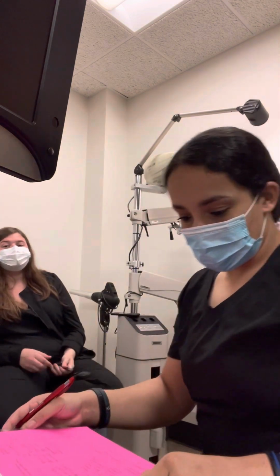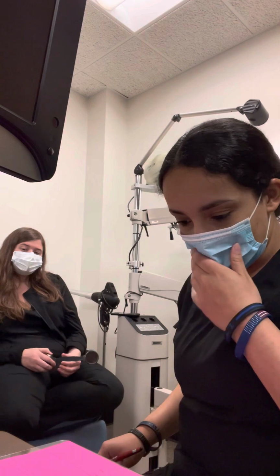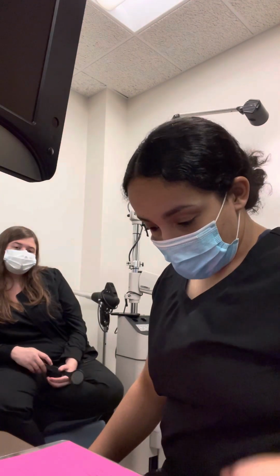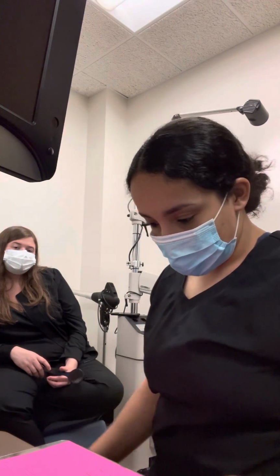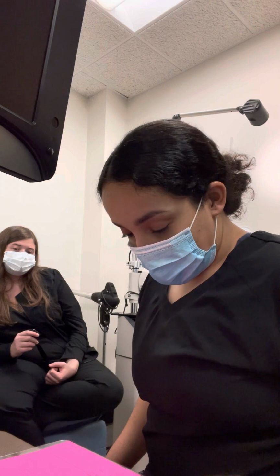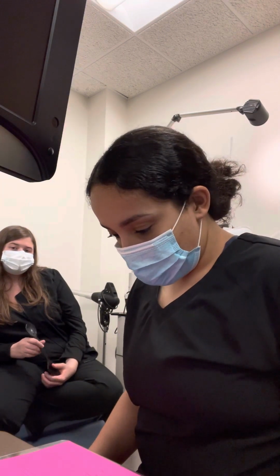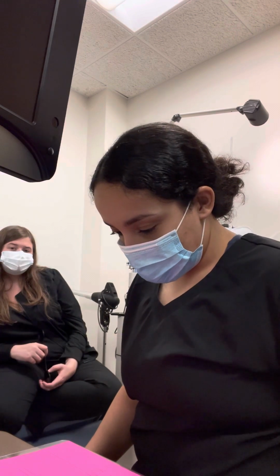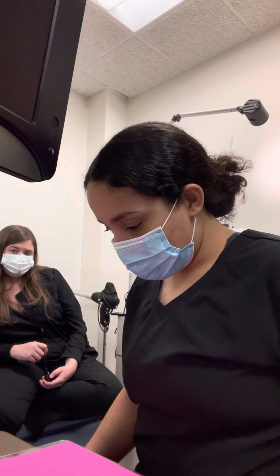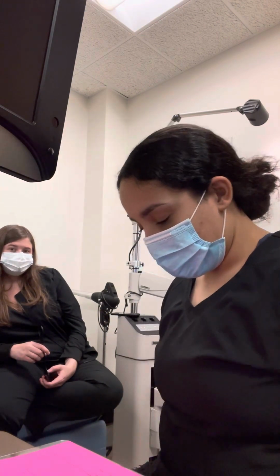Okay, so for her distance visual acuity with her corrections on, she has 20/20 in her right eye, 20/15 in her left, 20/15 in both her eyes. Without her corrections for distance visual acuity, she has 20/80 in her right, 20/80 plus 1 in her left, 20/80 in both her eyes. For near visual acuities, with her corrections on, she's 20/20 in her right, 20/20 in her left, 20/20 in both. And without her corrections for near visual acuity, she has 20/100 in her right, 20/100 minus 1 in her left, and 20/100 in both her eyes.